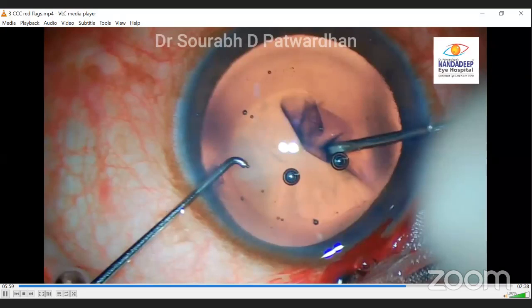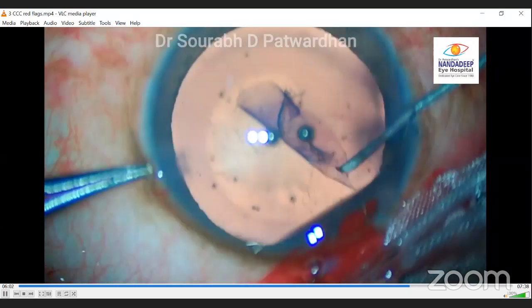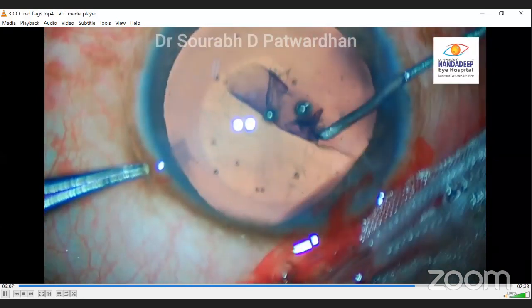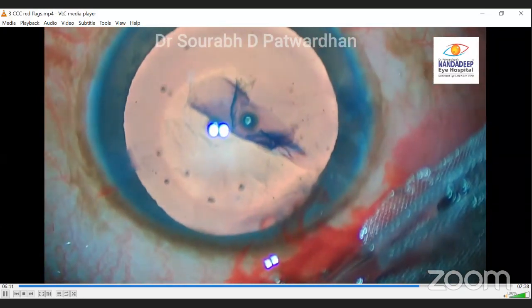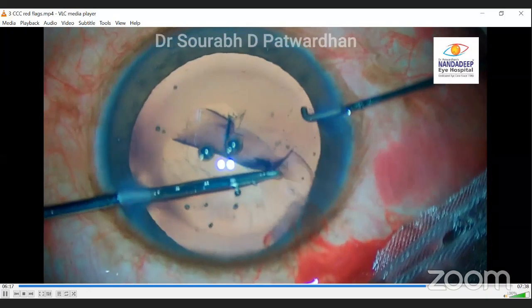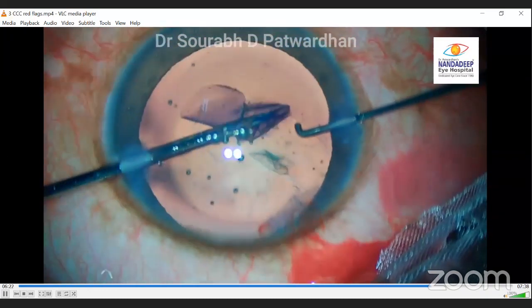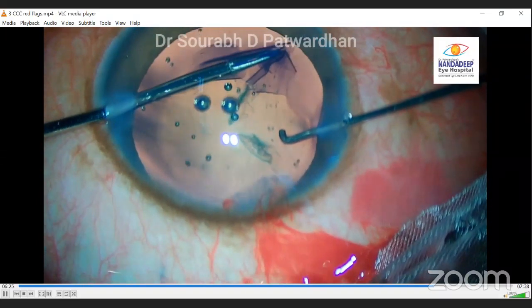So now what to do? The surgeon again, see, he is not following the Little's maneuver here. Maybe he's trying to do that, but now he left. So now I am going to do a quick pull maneuver. See this, how I pulled it back from the zonules very easily, and then I completed the rhexis.